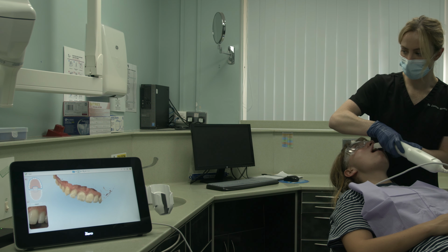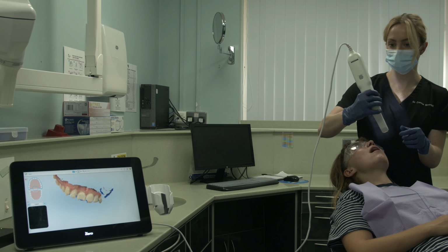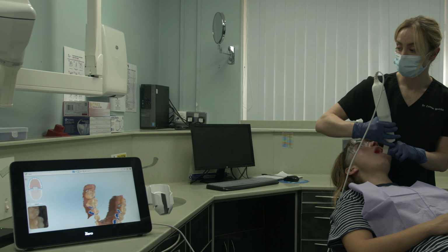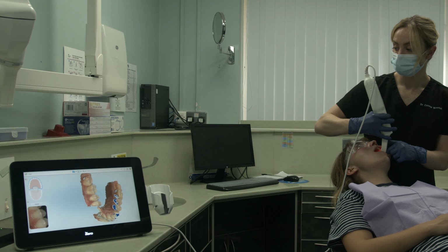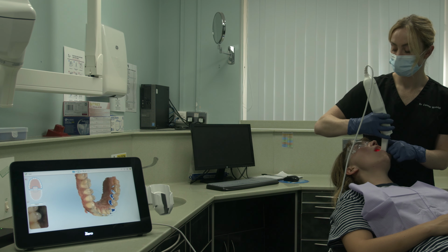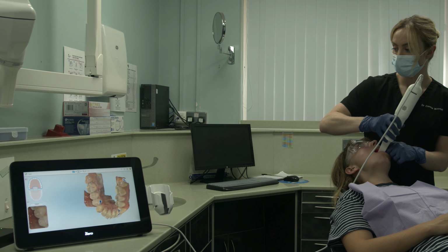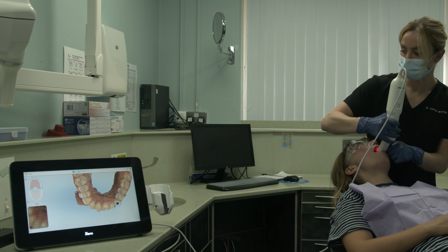I usually do half of the buccal and then reposition to do the other half. So if we just pick up again, the occlusal area, over onto the buccal side. Again, you can get the patient to move their jaw if that's helpful. And then back onto the palatal, just to get all those areas in blue which haven't been picked up.